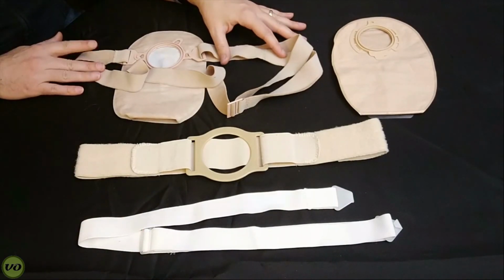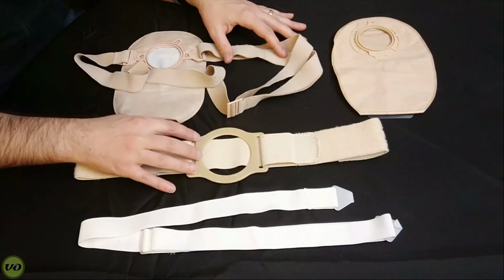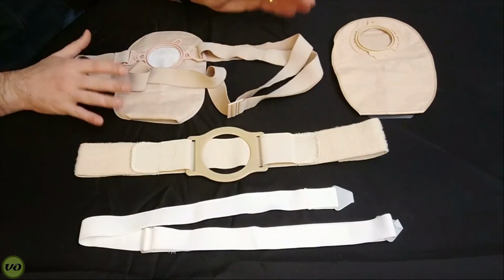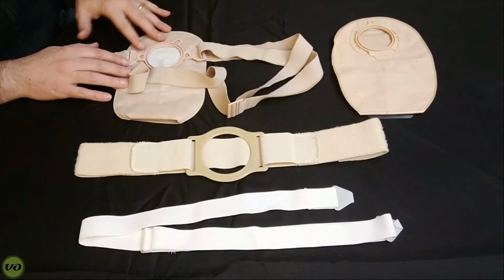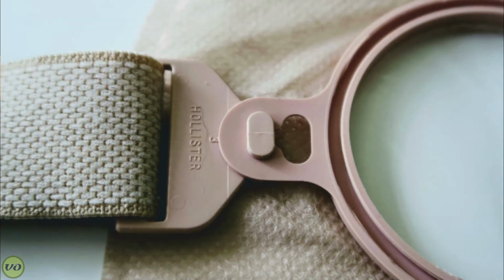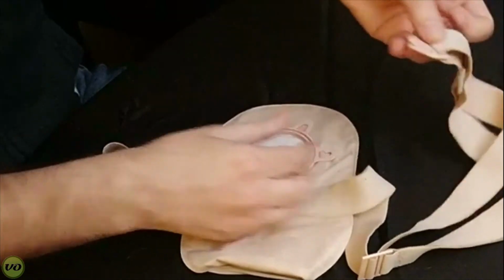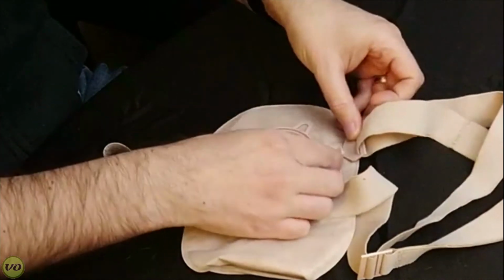This one here is by Hollister. This one is a New Hope belt, and it's quite a different design, which I'll talk to you about. And they all essentially function the same way. So you'll notice here on this Hollister bag, you have belt tabs. Now these belt tabs are where your accessory belt is going to attach to. And they come off and go on pretty easily.